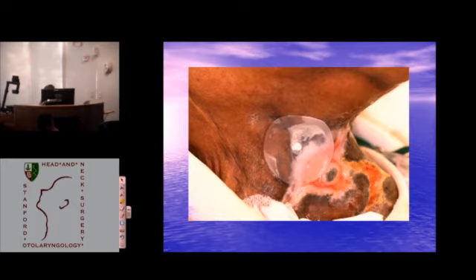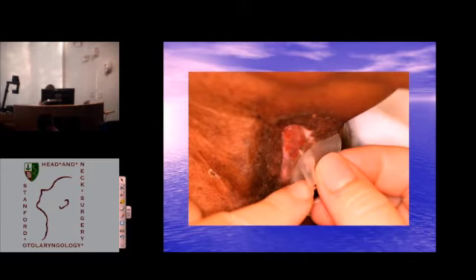But this lady, next slide, in her case, this is about 9 months later. And I don't know how many devices, because the flanges curl because of fungus on the inside, and then they leak. She could speak with her prosthesis. She had active disease going on, and she died of that disease. And that's why I'm surprised that this closed in as much as it did. It never fully closed.